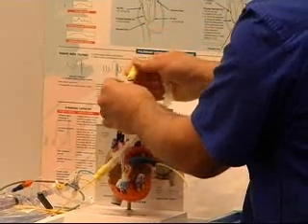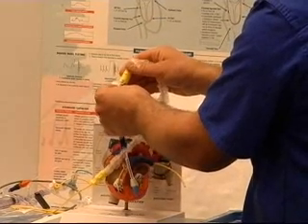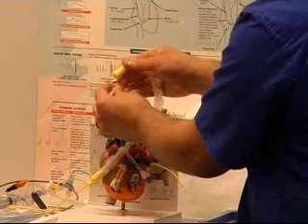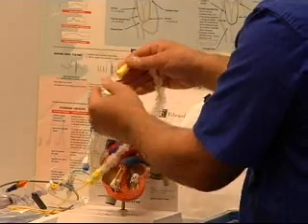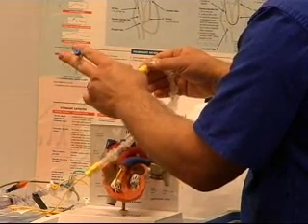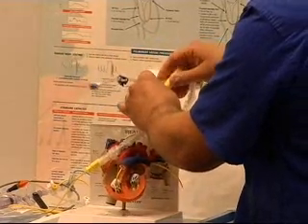The main thing is you don't want to be doing that on somebody's neck if it's sutured in and you're going to keep it, because that's really kind of painful. Don't do it to me. Anyway, you can see the importance of knowing this has a middle position and then a lock on either side. So if you always remember that the little barb that it hooks on is in line with the sidearm, with these type of catheters, that's what's going to be consistently the same, okay?